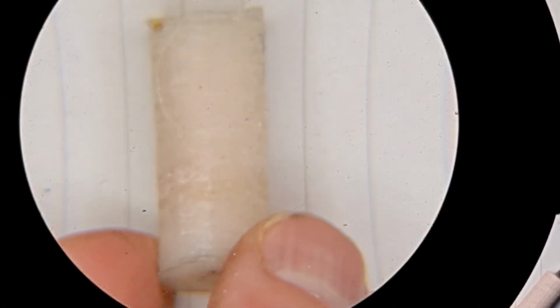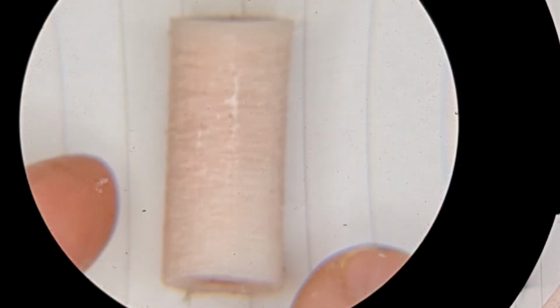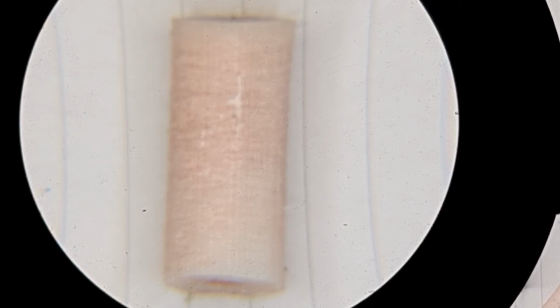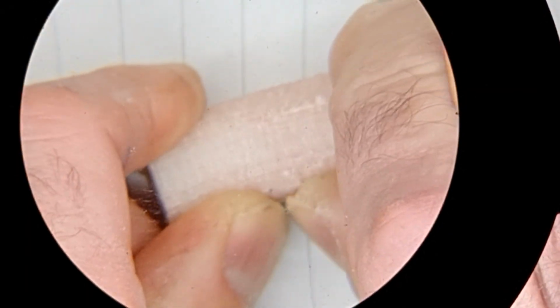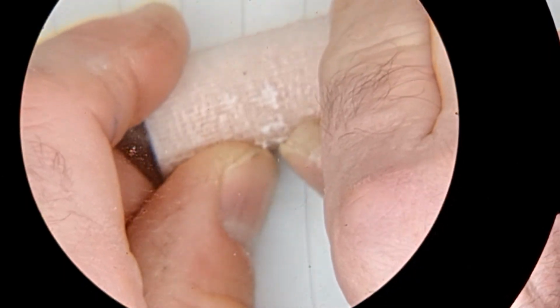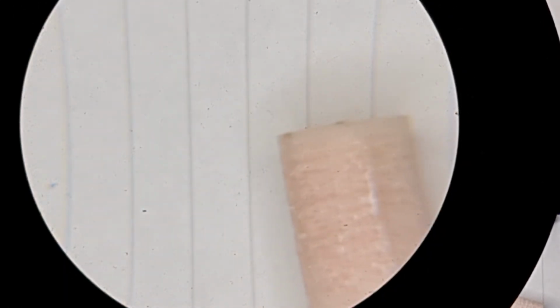This is a silicone one in here, and I've got an interesting mistake also that happened with this one, which is where I tried it without the wall. On the 3D print there was no wall, and the silicone soaked out into the print, into the flexible plastic itself, which again has had an interesting effect, and I think this might well work on some other things. So we've basically got silicone infused into that flexible print, and that does make for an interesting feel, I have to say. So that's where we are with that.